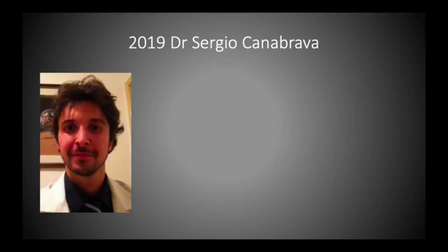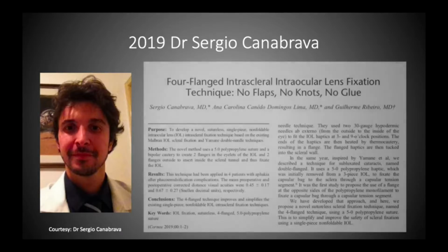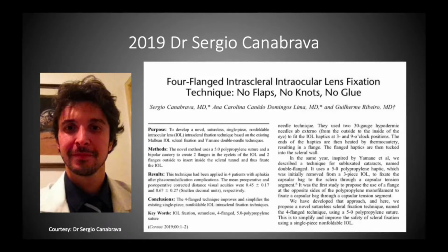In 2019, Dr. Canabrava proposed a sutureless sclera fixation technique named the 4-flange technique with no flap, no knots, and no glue. These are the simplified steps for the 4-flange technique.